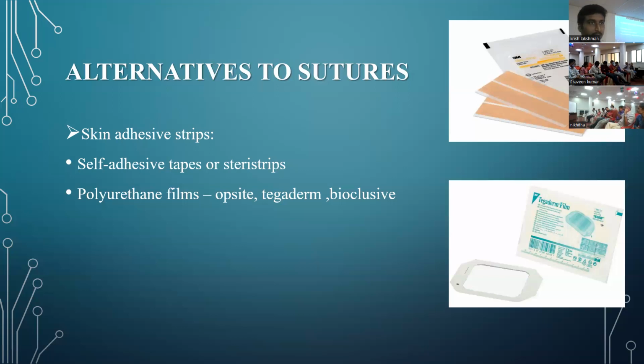While we are at it, before you go to the next one, there is also the concept of locking the suture in a continuous closure. Do not lock. When you have a continuous loop all across the whole wound, the theory is that if it gets snapped somewhere, the whole thing falls apart. My contention is it should not, you will have used a proper suture and a proper knot, it should not fall apart.